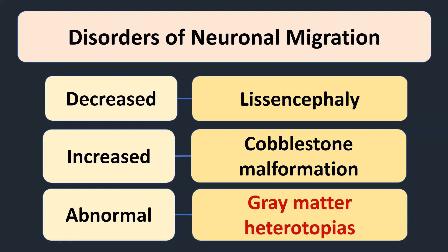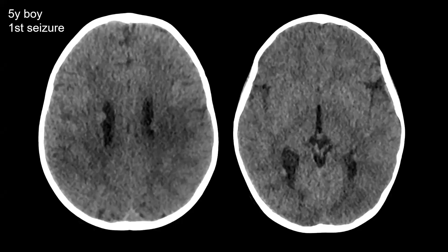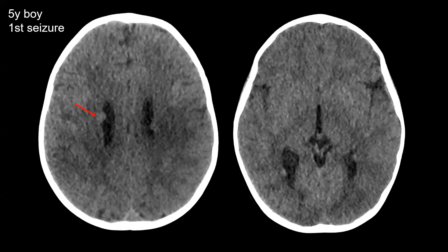A band heterotopia, or so-called double cortex syndrome, can be considered a gray matter heterotopia. This is a five-year-old boy brought to the emergency department because of a first-ever seizure. On this unenhanced CT of the brain, we see several small nodules protruding into both lateral ventricles. They are very discreet, but this was picked up by our radiology registrar on call.